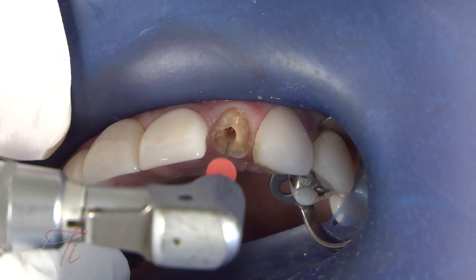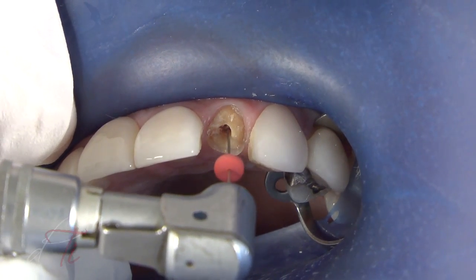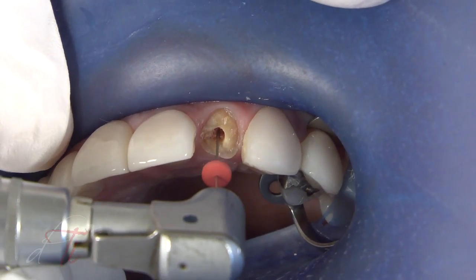The gutta percha is removed with a series of Gates Glidden drills — a number one, a number two, and a number three — to the established predetermined length.